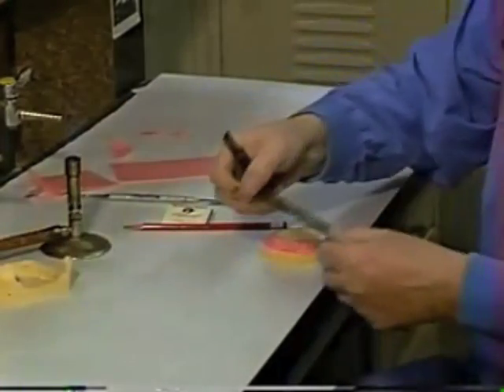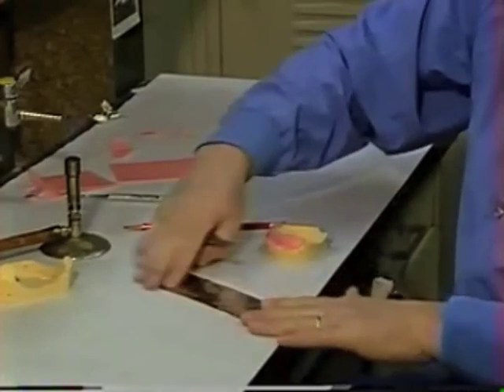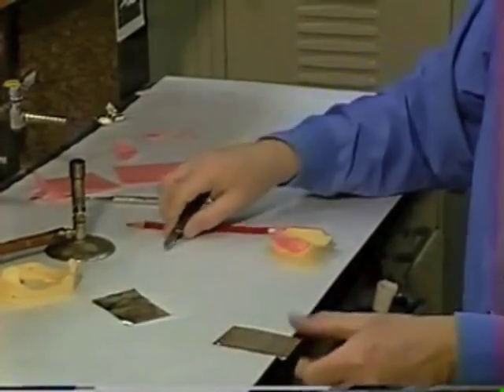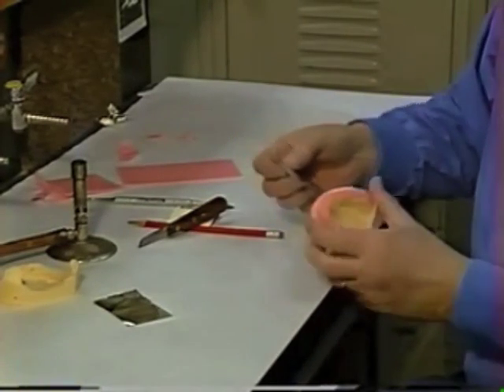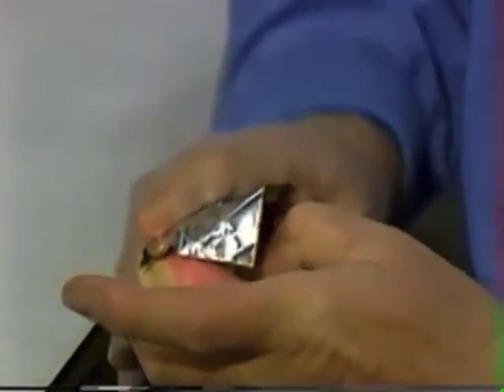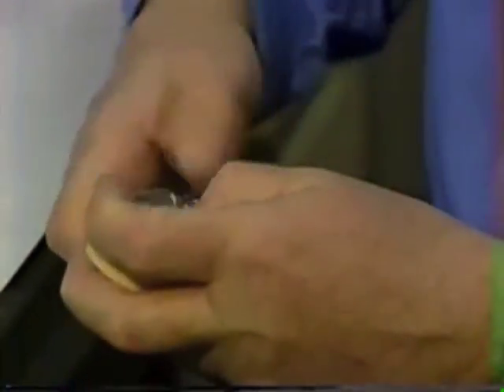We can set the tin foil aside now. What we're going to do is cut this in 2 pieces, and we're going to adapt the tin foil now to the cast. Lay 1 layer of it on and adapt it with your finger real well. Push it down onto the cast real well.